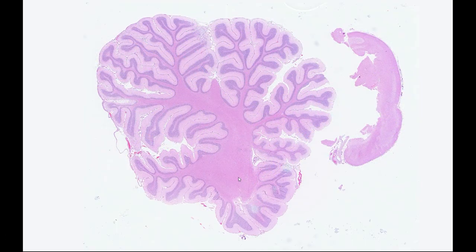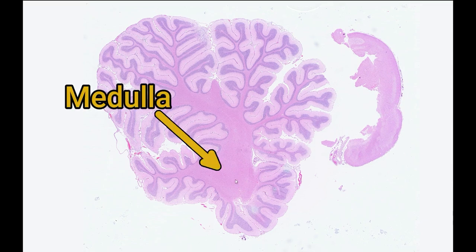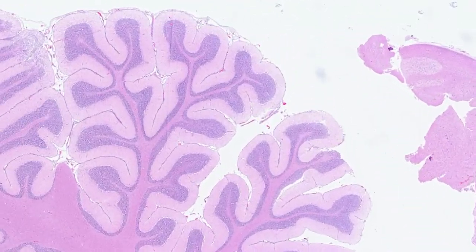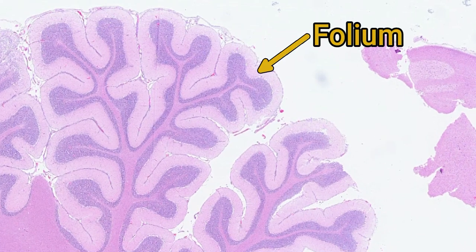Looking at the cerebellum at low power, we can see some macroscopic anatomic features. At the root of the cerebellum there's a central core of white matter. Sometimes this white matter is referred to as the cerebellum medulla, following the standard anatomic naming of medulla in the middle and cortex on the outside. This sends out branches which then branch once more and head off into the cerebellar cortex. Each individual white matter core with its cortical covering is called a folium, or folia in the plural.